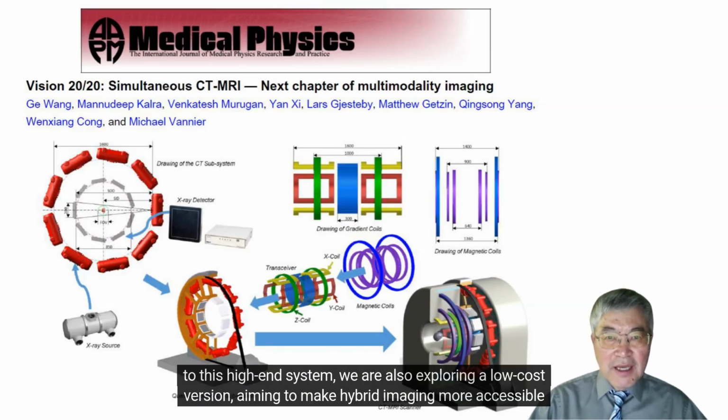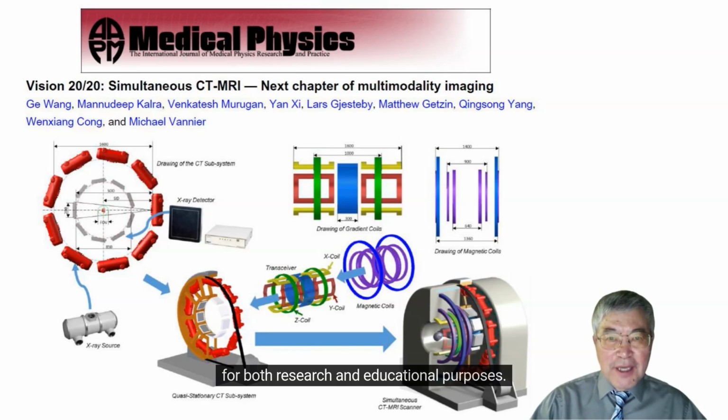In addition to this high-end system, we are also exploring a low-cost version aiming to make hybrid imaging more accessible for both research and educational purposes.